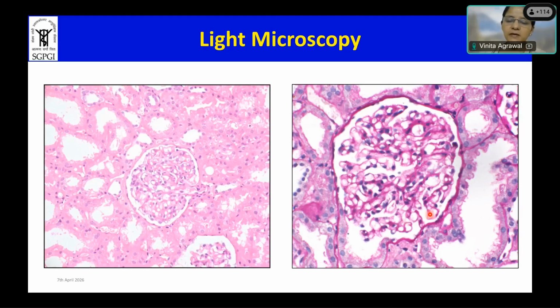So this is the area of the mesangium which is surrounded by loops. So this is the mesangium, right? You can see my pointer. So this is a mesangium and you can see maximum 1 or maybe 2, but this is also the endothelium. So I have only 1 cell or maybe no cell here.